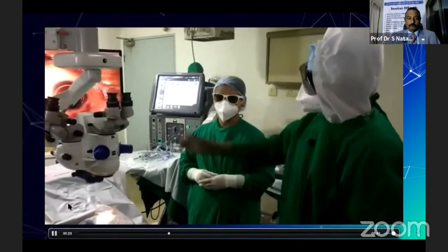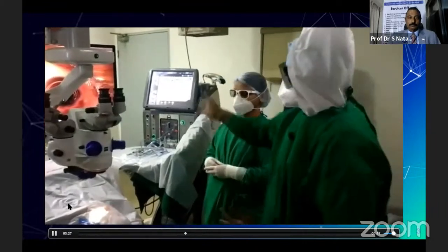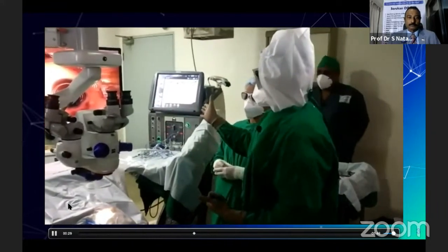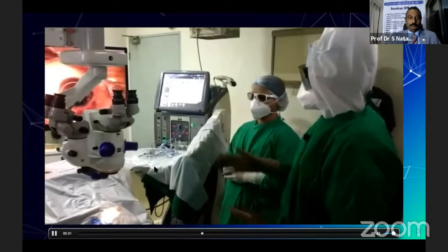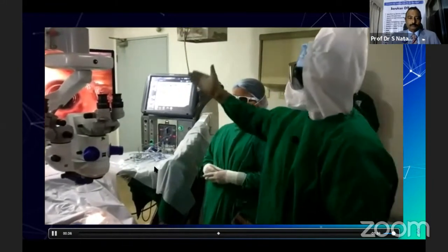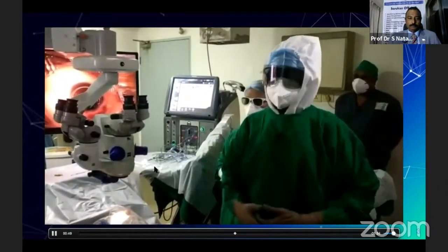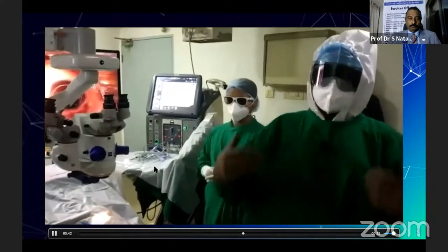She's a wonderful assistant. We use the world's best technology, the Alcon. Again, I don't have any financial interest. The Alcon Constellation system for vitrectomy, endolaser, and the 3D system. And I'm routinely doing this 3D surgery, and I wear the 3D glasses, which also helps to prevent corona.